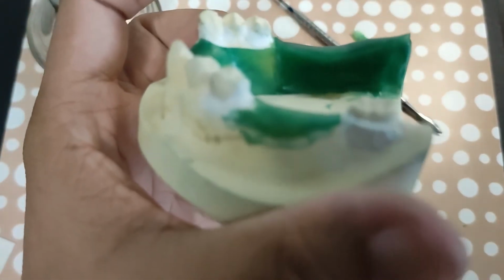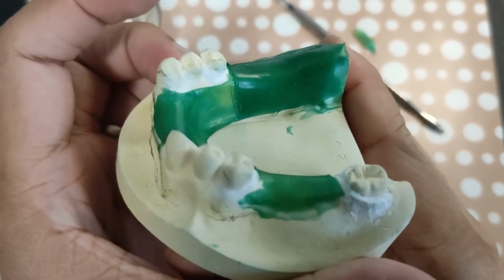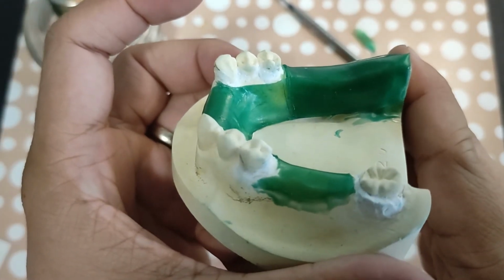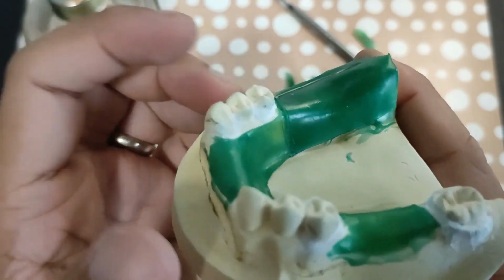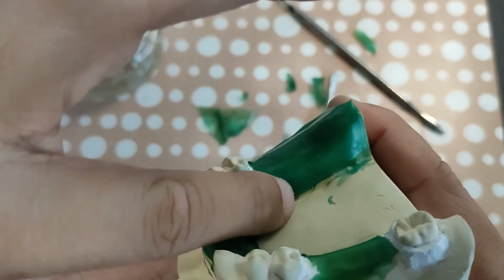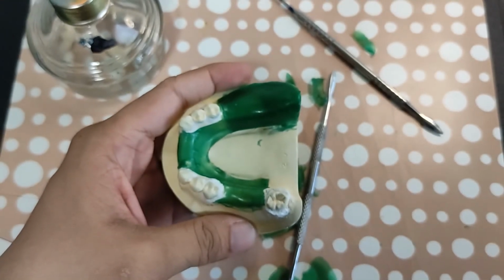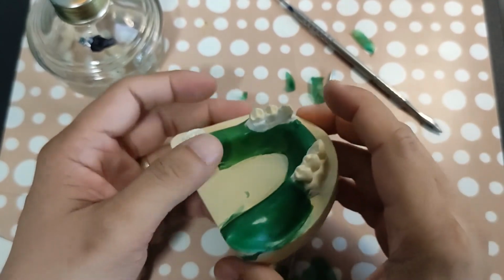You can see. Okay, so that is a distinct internal line angle for a secondary layer. Alright, it doesn't have to follow any form. You just need to add relief here. Alright, so what we do next is the other parts for the relief here and there.